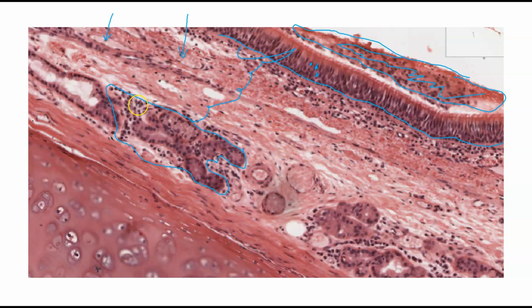So we were just talking about these simple cuboidal clumps over here. This is our submucosal gland. The last thing to find is hyaline cartilage. And we know, because we are awesome anatomy students, that we can find cartilage easy because those cells have lacuna. It's got that little open space around them. And bada bing, bada boom, what do we find down here? Cells with lacuna. It's also very glassy in appearance, very smooth, and that is hyaline cartilage.